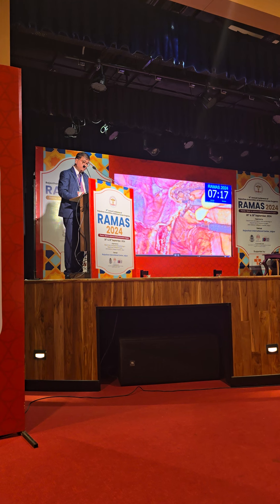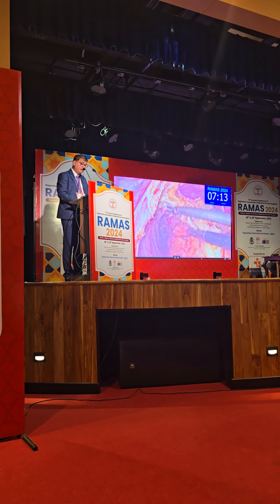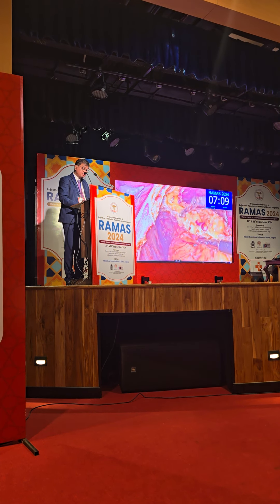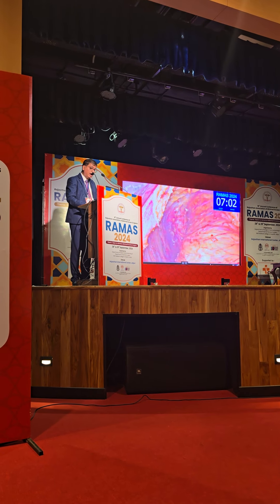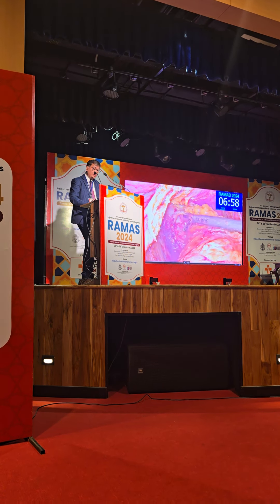Through this you achieve complete mobilization of the rectum until you reach the pouch of Douglas again. The endpoint is to go up to the levator ani muscle. The fat belongs to the rectum on the lateral side — always — and also on the anterior side. Now you can see the endopelvic fascia covering the entire area so nicely.